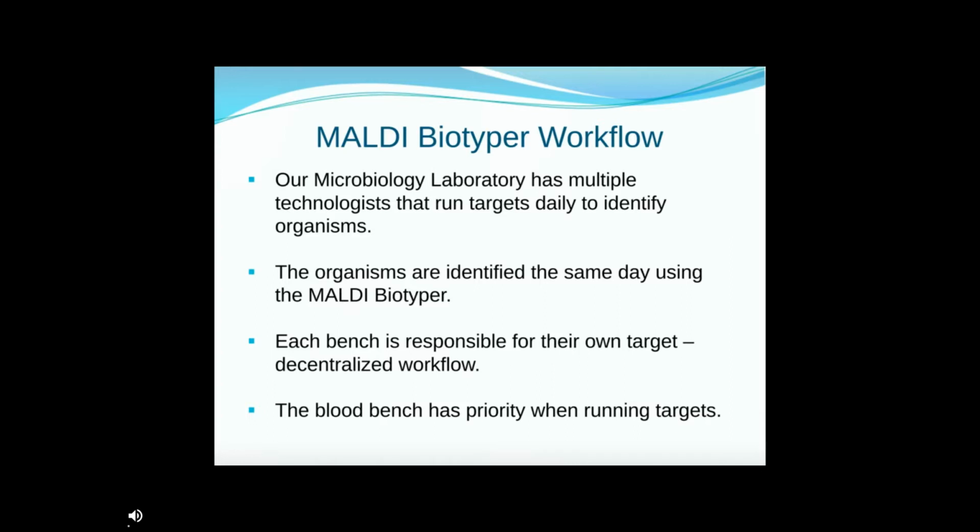And everybody works great as a team to decide who's going to go on the MALDI first and take turns, but the blood bench always does have priority. That is the first target that usually goes on in the morning, so we can get the identification right out to the clinicians so they can change, treat, use it however they like for their therapy for their patients.